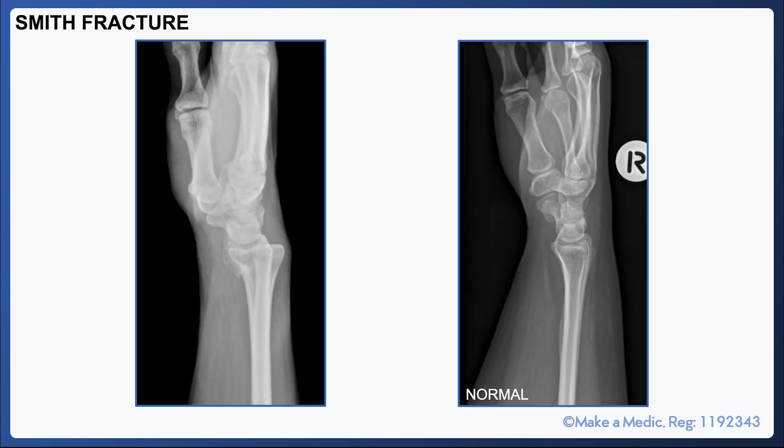On the lateral view, however, you can clearly see that the distal radius is displaced in a volar direction, rather than a dorsal direction.